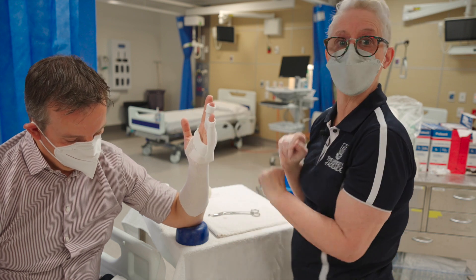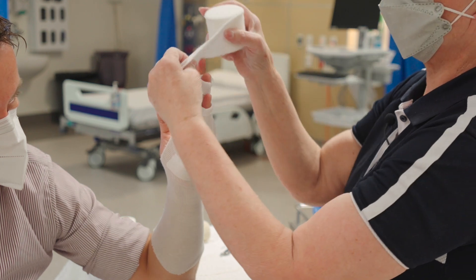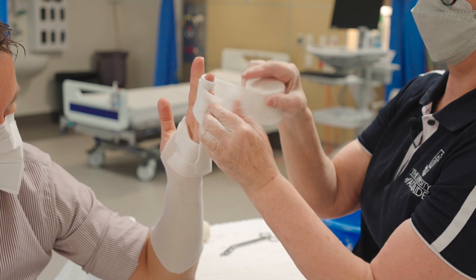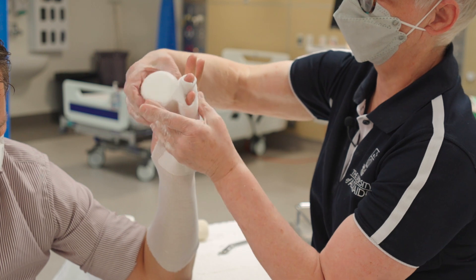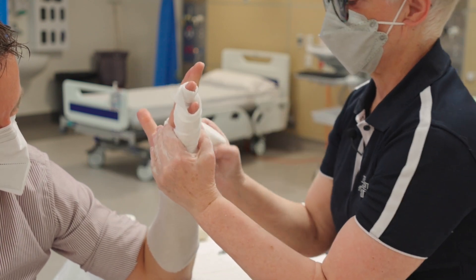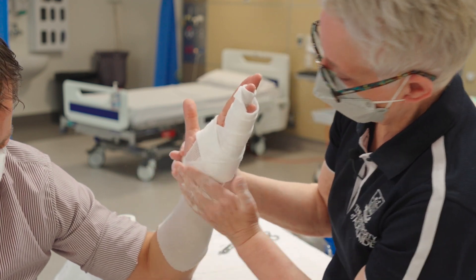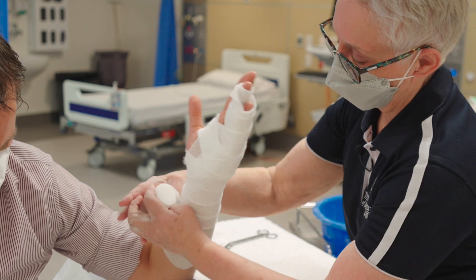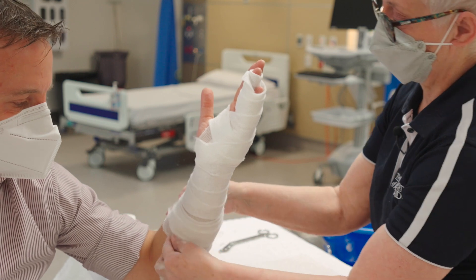It's important to see the fingertips so you know circulation is not being compromised. Take the soft band and slide it between the two fingers, starting at the top — always start at the top so you have the correct length. Come up just past the fingertips, angle down, and make sure you can still see the little finger. Make your way around the hand, going twice around the palm crease as per guidelines. Continue around the wrist ensuring adequate coverage, then down the arm, doing two rolls at the bottom. The reason for two rolls at the bottom is that you'll fold these edges up and need padding there against the cast.